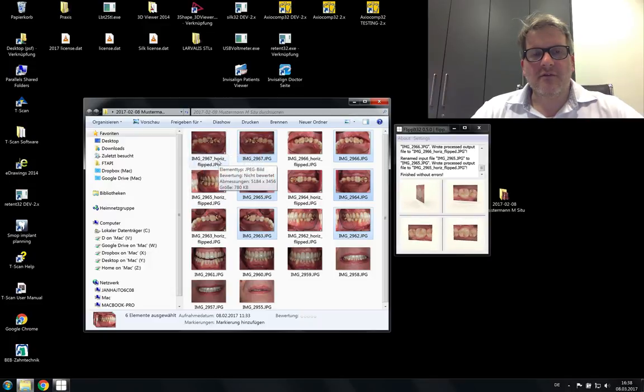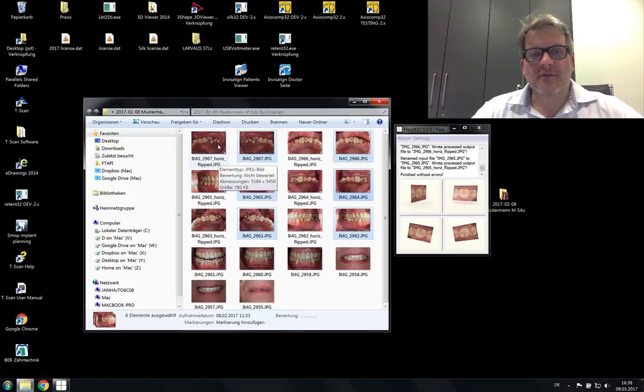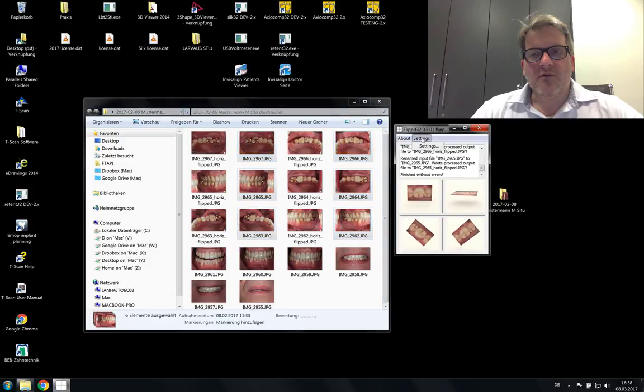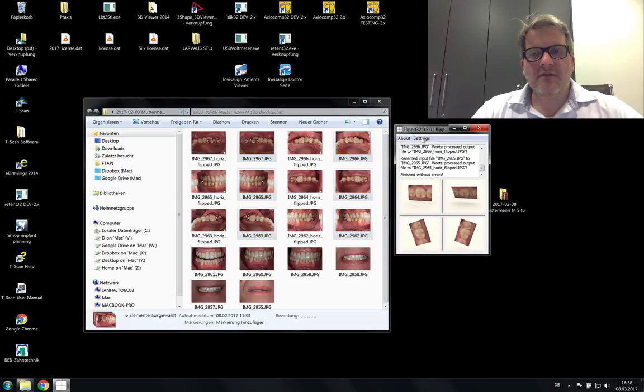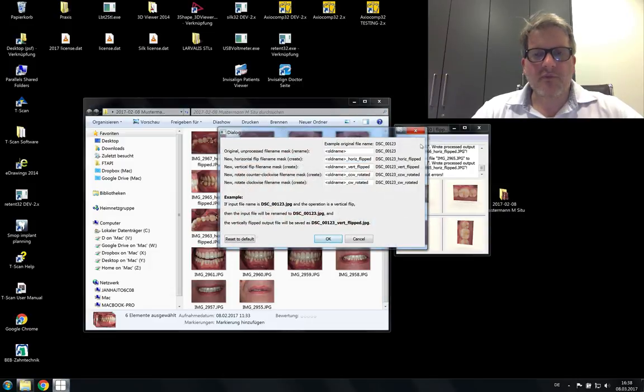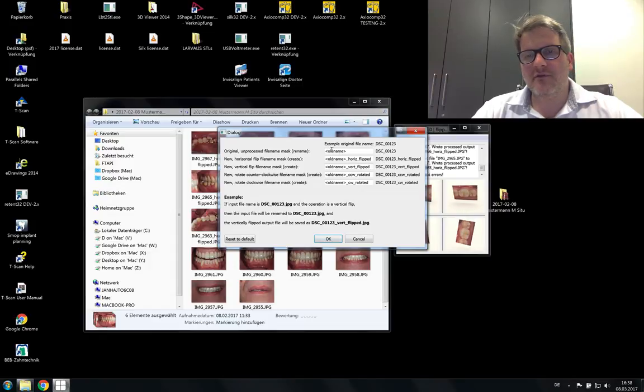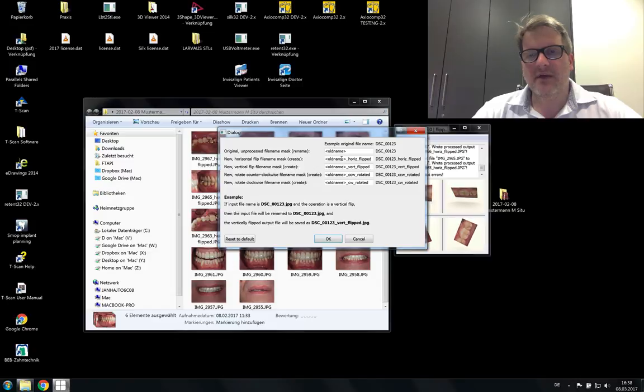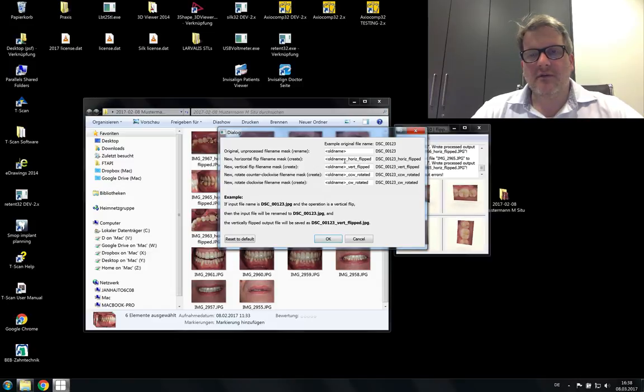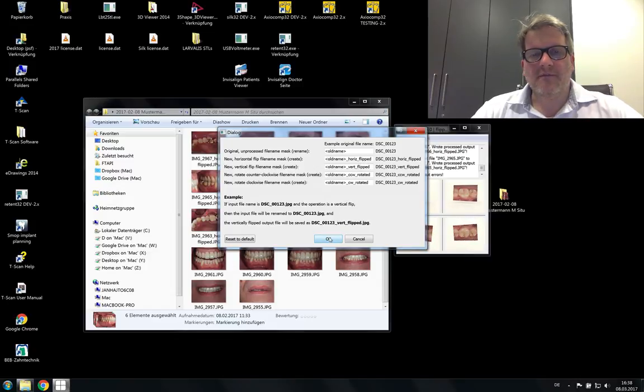Here it says horizontally flipped. You can define yourself in the settings how you want the images renamed. Also the original pictures you can leave their name or rename them. And this you can set yourself.